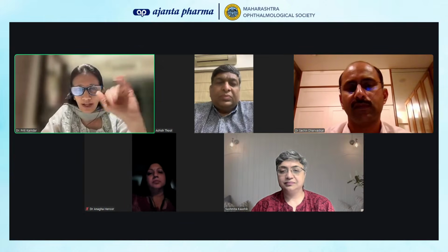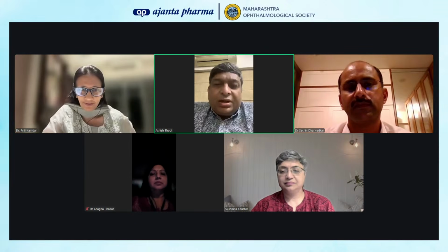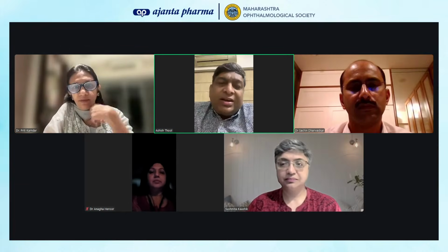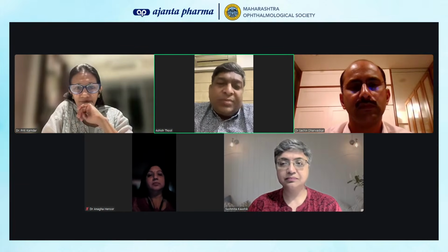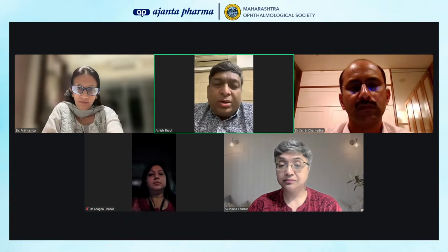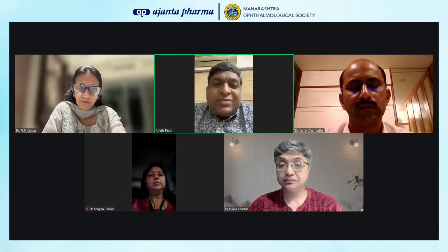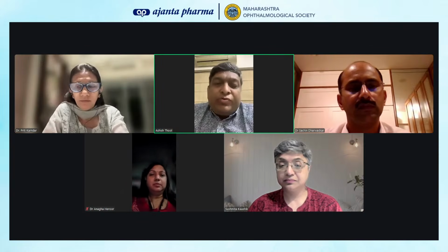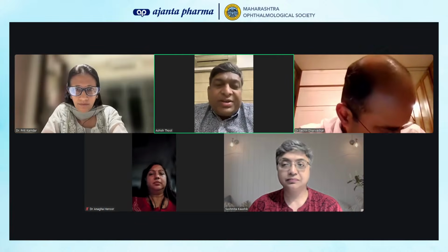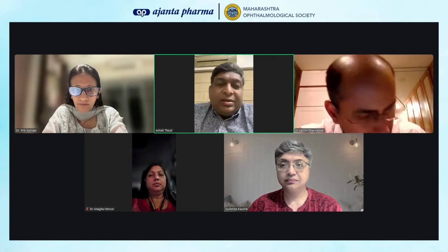Dr. Ashish. One last tip. For image acquisition, the routine protocol that we follow is that the first thing we do is get an OCT before subjecting the patient to eye examination. If your image quality is good, great. I'm talking about a glaucoma suspect who is coming to you for an opinion, or if it is a follow-up test also. First, the patient will be subjected to OCT, then the examination part.